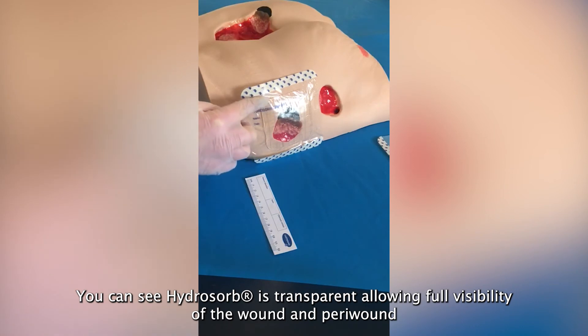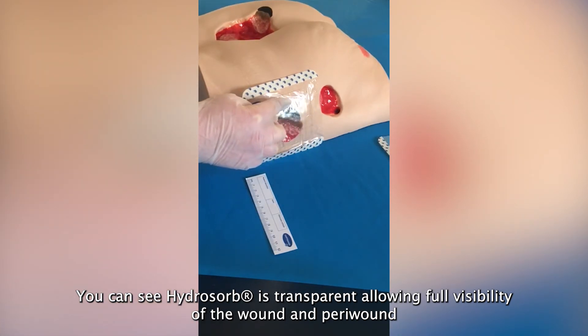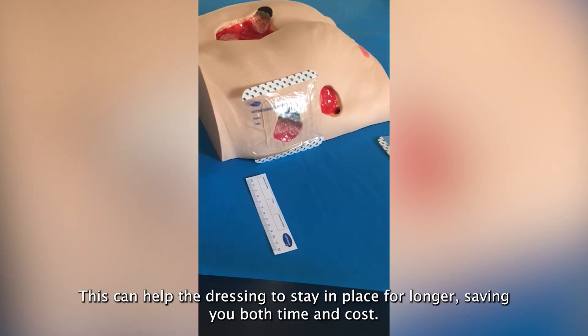You can see HydroSorb is transparent, allowing full visibility of the wound and peri-wound when looking for any signs of cellulitis and erythema. This can help the dressing to stay in place for longer, saving you both time and cost.